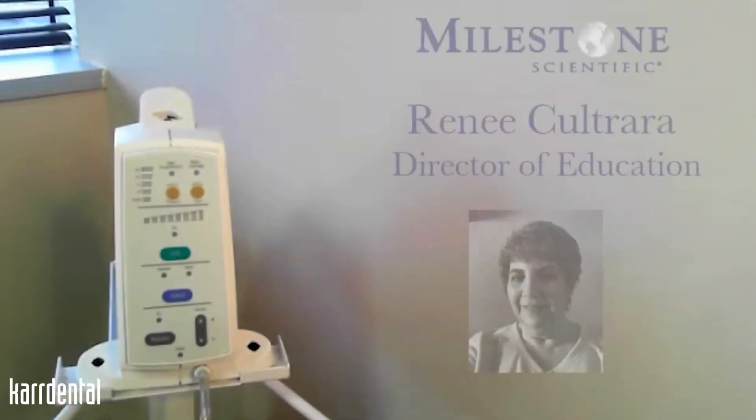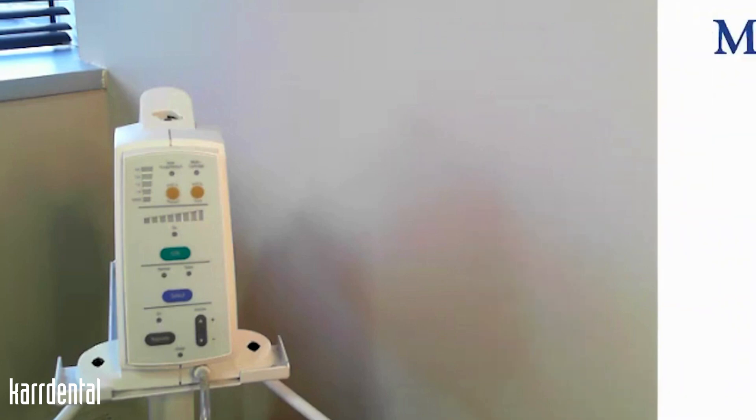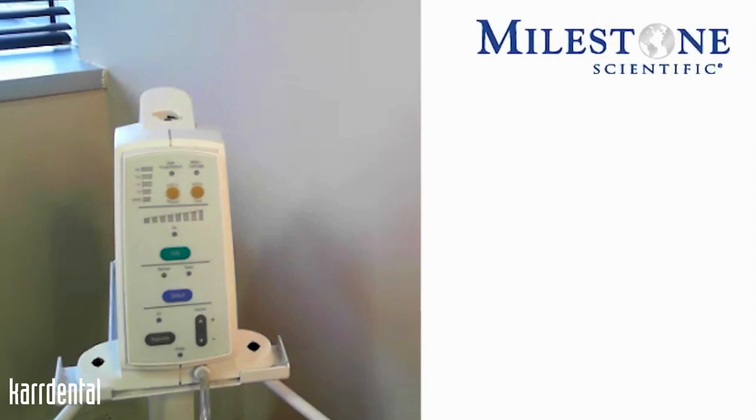Hello, my name is Renee Coltrera, and I'm a dental hygienist and the Director of Education for Milestone Scientific. I'm here today to show you how to effectively demonstrate the single tooth anesthesia delivery system.